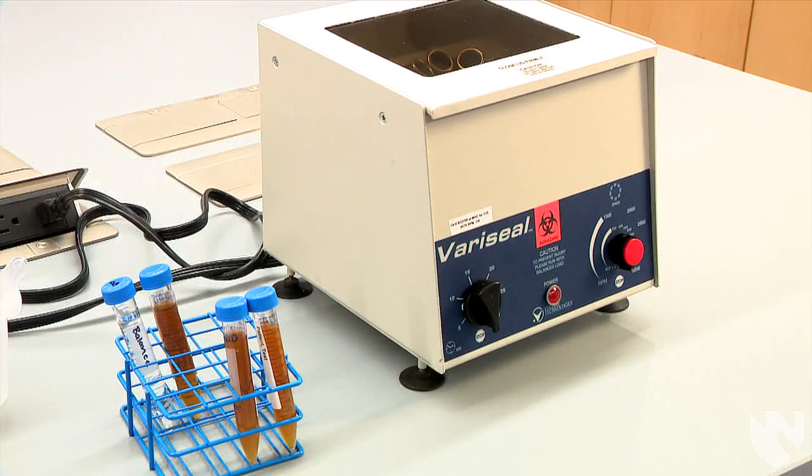In this video, we will demonstrate the proper way to centrifuge a urine specimen, decant the supernatant, and re-suspend the sediment in preparation for creating wet preps.